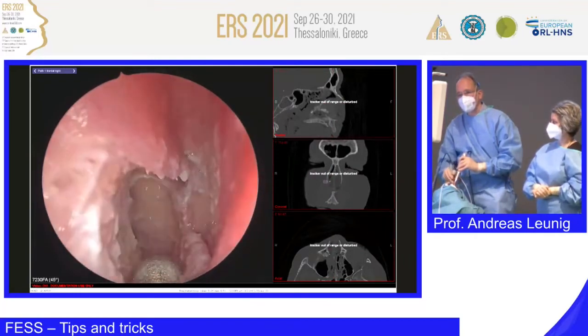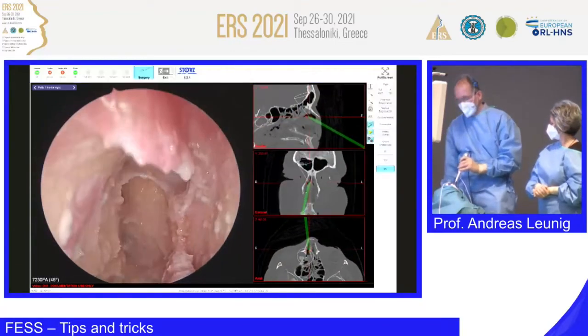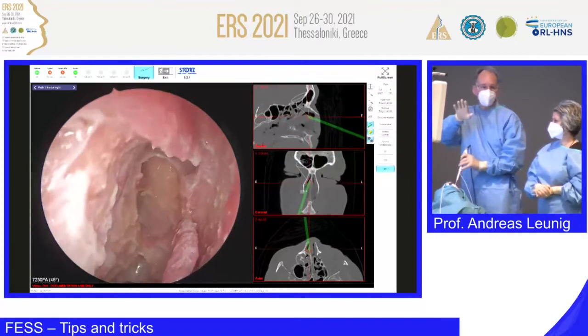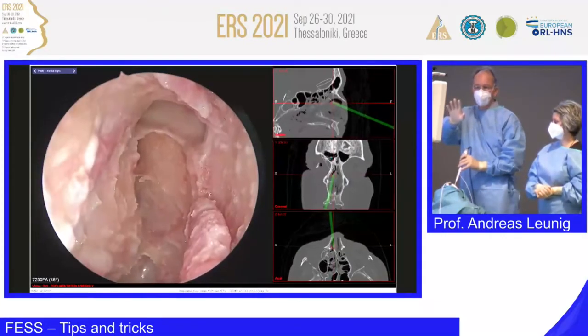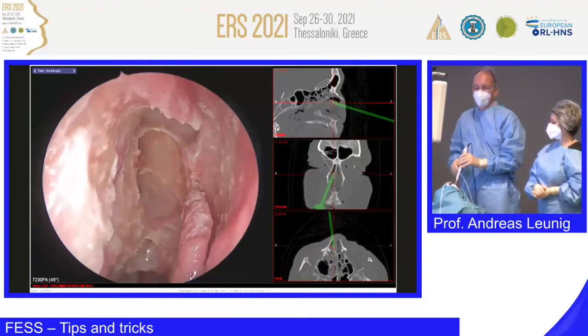So, I think this should be fine now. It's a wide opening, you can see it. And this won't stenose; this stays open, I'm sure. There's no risk of restenosis.